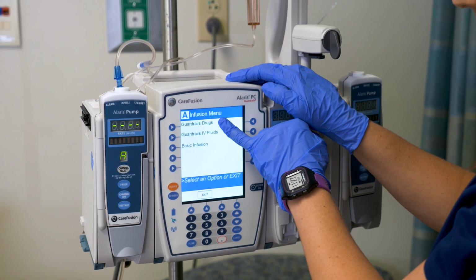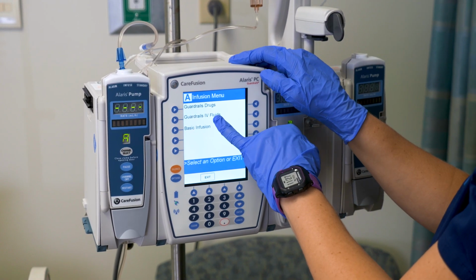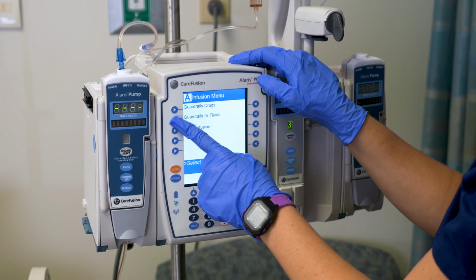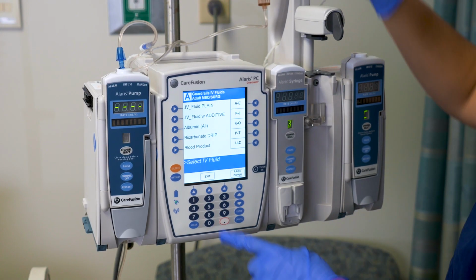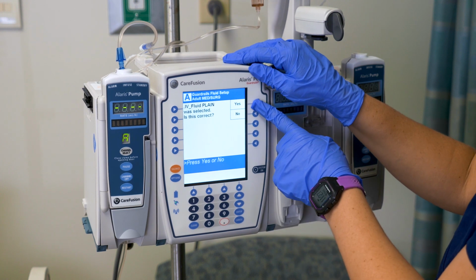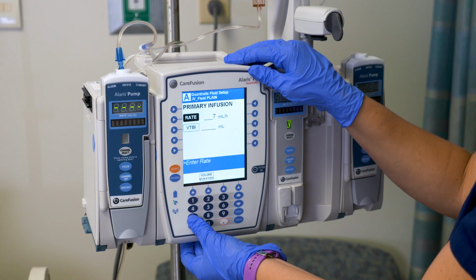We are going to follow, we're not giving a drug, we're giving IV fluid. Guardrails is a system that is designed to prevent medication errors. We have plain normal saline, so we're going to select out IV plain. Is this correct? Yes. Our rate, as per ordered, was 75 mLs per hour.